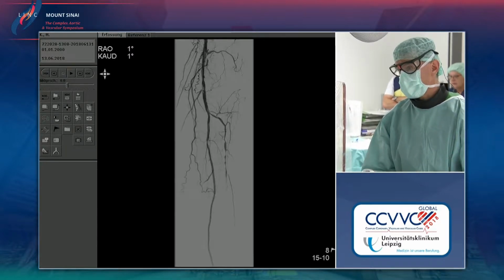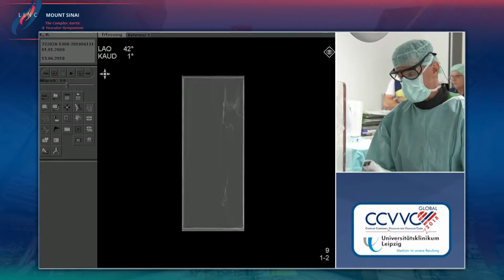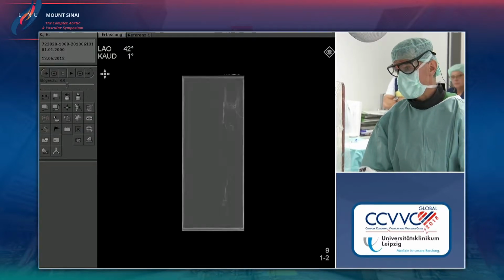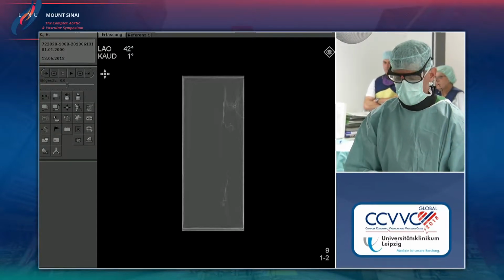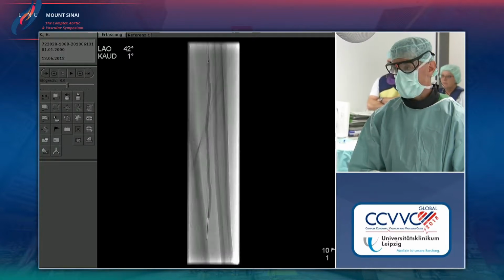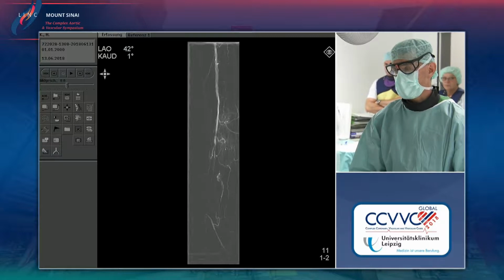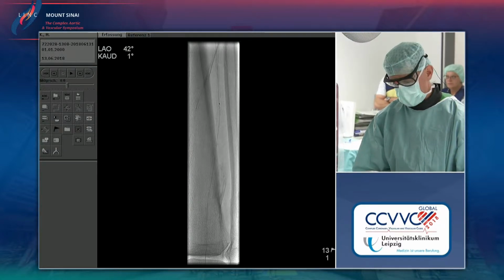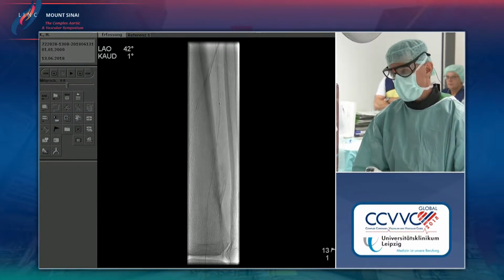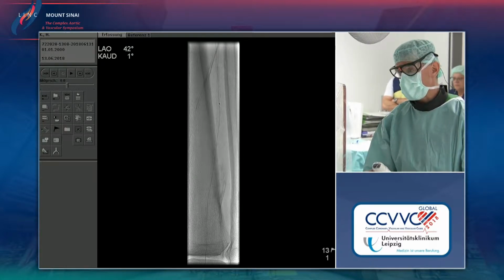And so we passed the wire to the distal portion, then the wire perforated. It was not so easy to get down here, but at the end it worked with a PT2 plus WIN 200T. And then we predilated here, still some traces of that perforation. And then as I said, the WIN 200T went down. Once again, I think you can now appreciate that wall calcification.